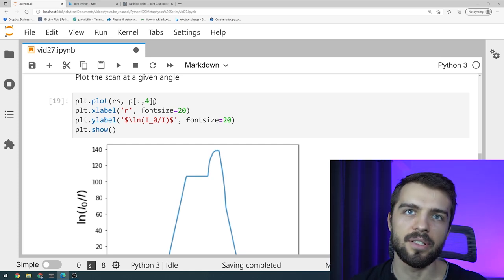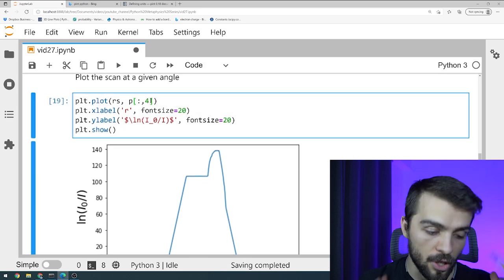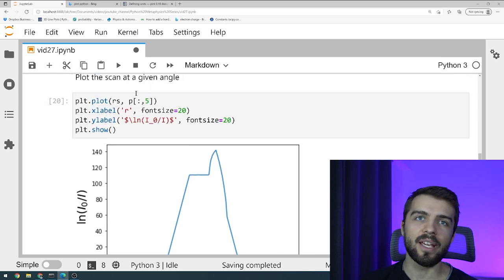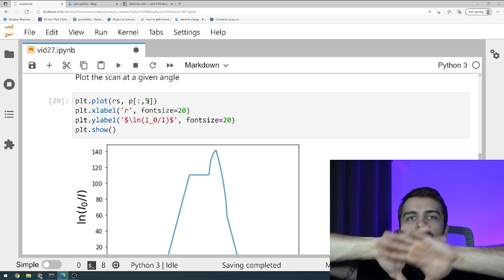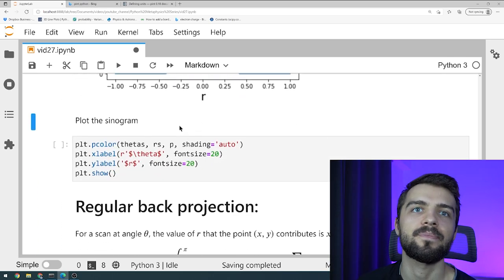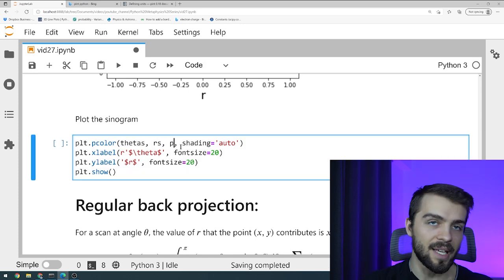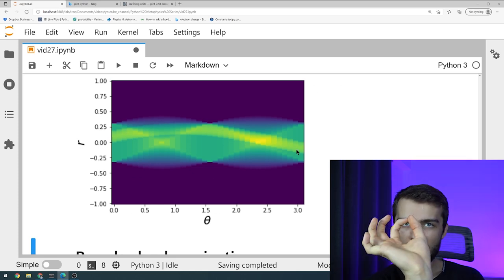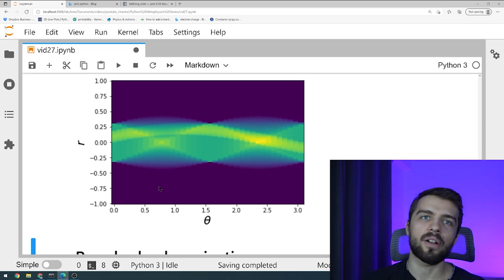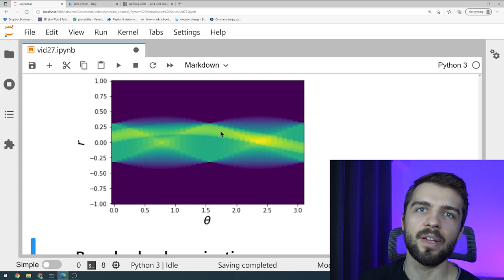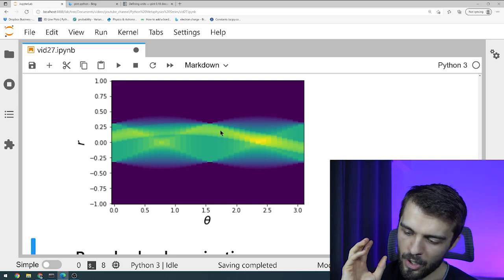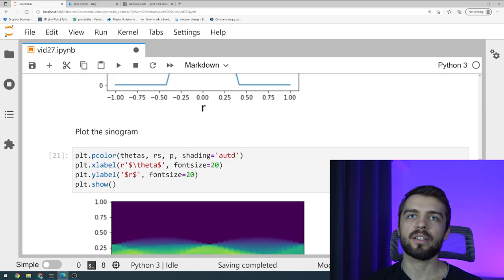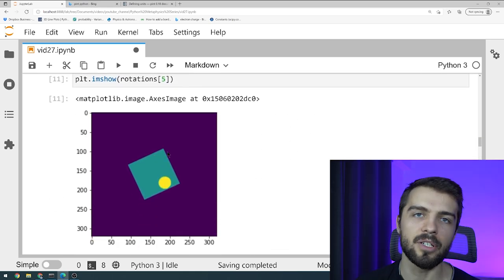Rather than looking at it just for a particular angle, I can also plot the 2D array — this is called the sinogram. I plot it for all different values of thetas and r's. You can see why it's called the sinogram because it almost kind of looks like a sine curve. When you have a point, that point becomes a sine wave on this diagram. This is what you measure when you're taking a medical image of a patient — this is the raw data. And you want to use this to reconstruct the square with a circle in it, or in the case of a patient, something obviously much more complicated.